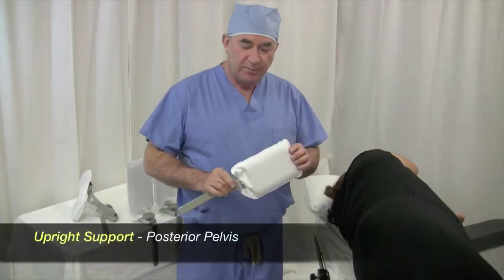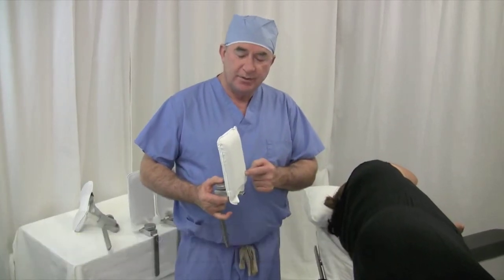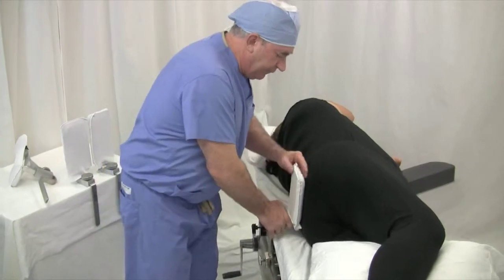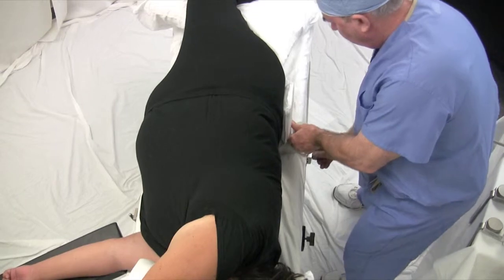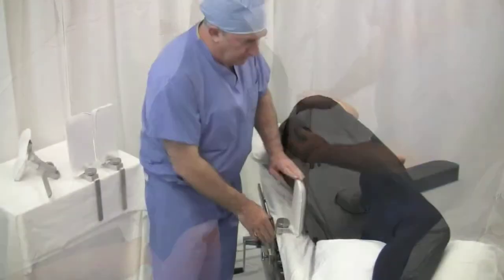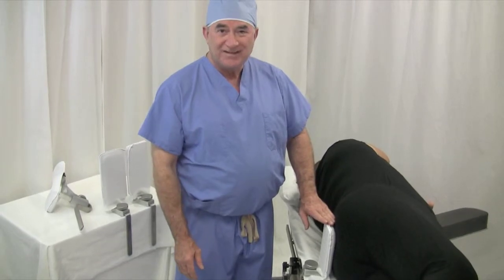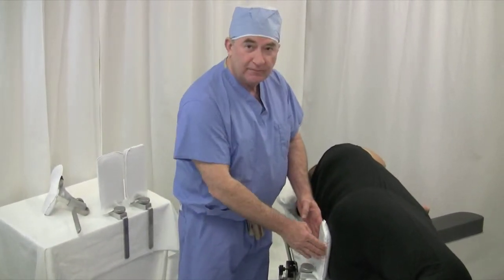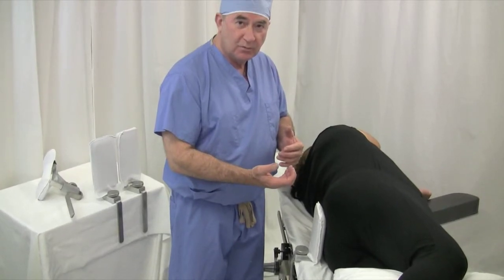I always place the posterior pelvis support first, at the two posterior superior spines and sacrum. Adjust it so the pad is just above the upside posterior superior spine and well centered over the sacrum, so you get three points of support. Use a small bar to keep the patient's pelvis towards you.